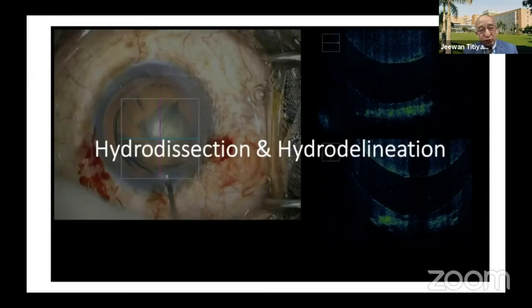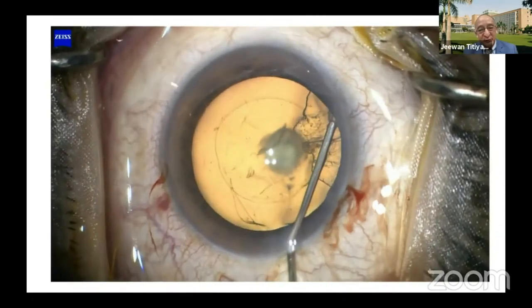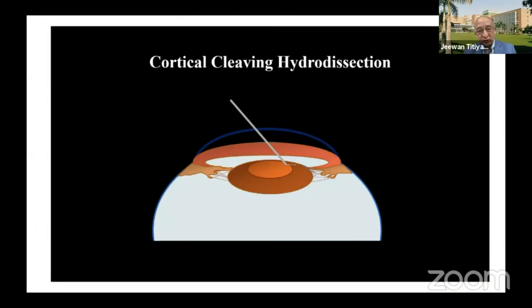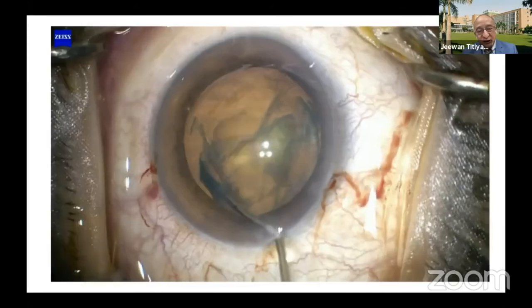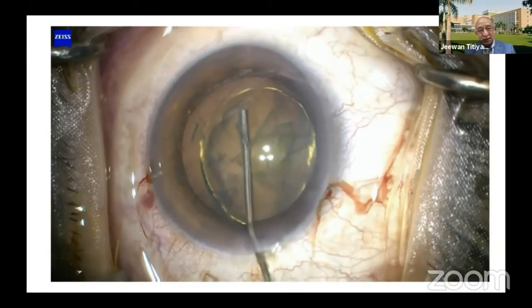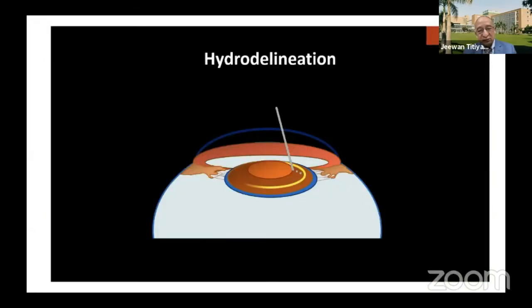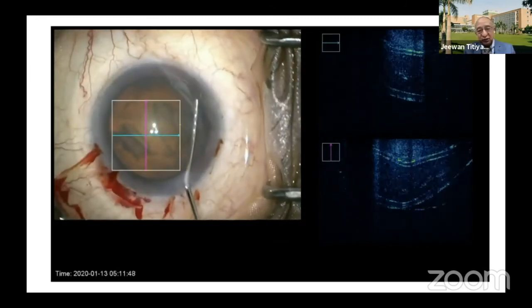Another important area is hydrodissection and delineation, where normally we don't see the three-dimensional picture, which is only possible with iOCT. Like you can see here, we have done a hydrodissection just by looking at a fluid wave, and the anterior displacement of the lens diaphragm doesn't tell you exactly what has happened. So here we are trying to do a delineation. With delineation also, just a picture of a ring tells you that delineation has happened, but you don't know how much fluid you have injected.